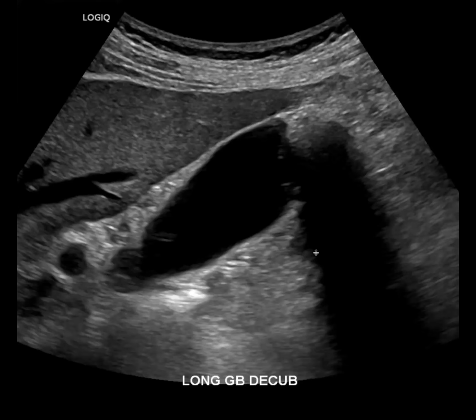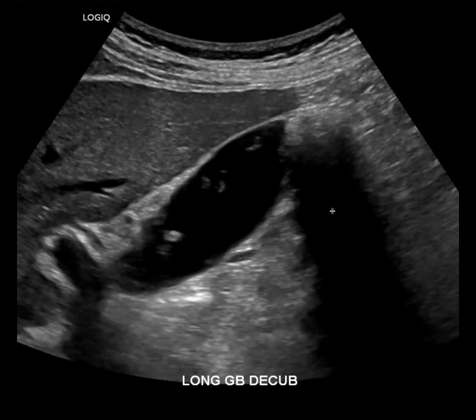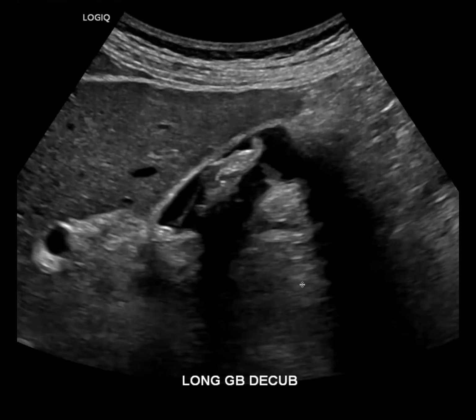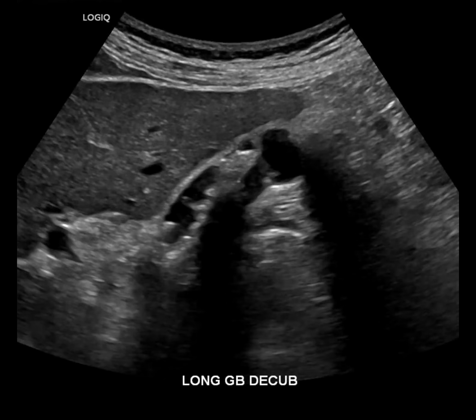Oh, nice, you have an ultrasound. Yep, this is our fundal sludge ball. On that ultrasound, wouldn't you have called that a stone given the shadow? Yes, exactly. And then this is that luminal finding. Also lots of shadowing. But I think it's worth exploring because it's different.